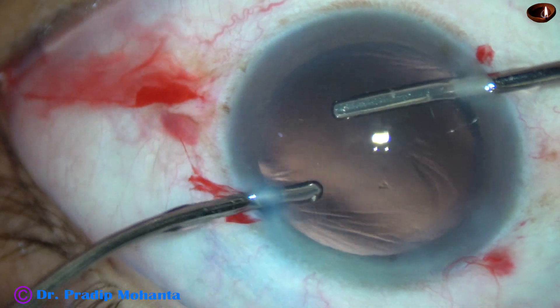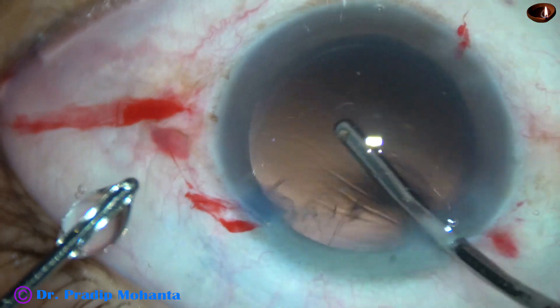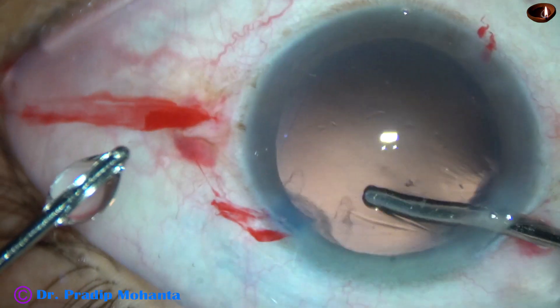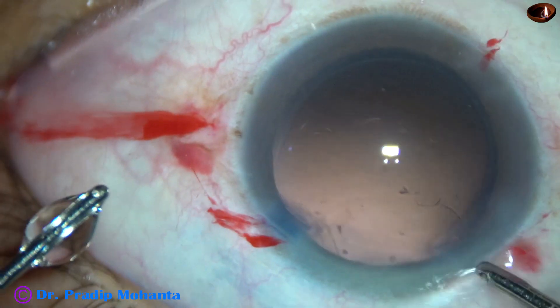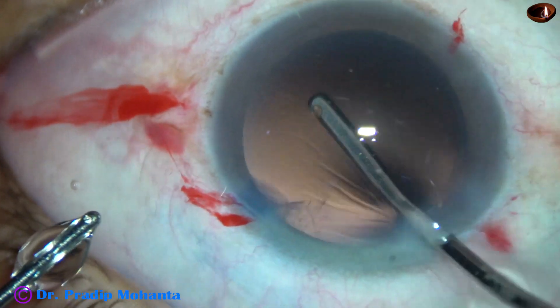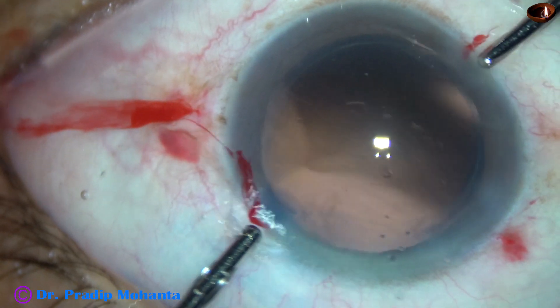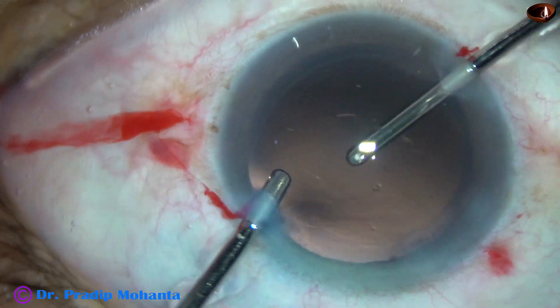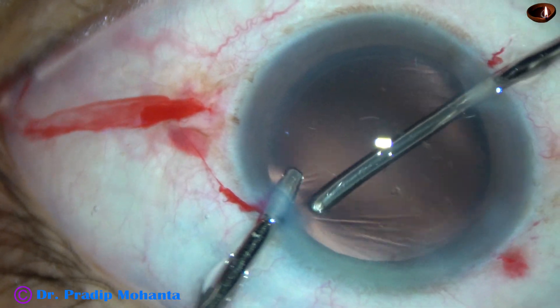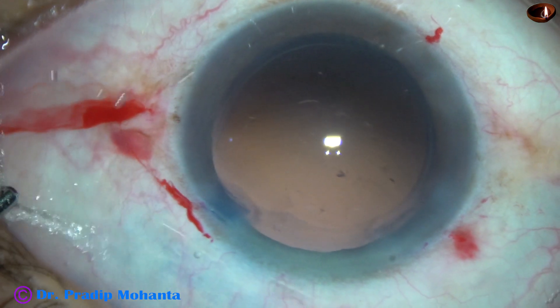See how easily the cortex comes once you hydrate it with your irrigating cannula. So all the cortex has come out — only a few fibers remain at the sub-side-port area. I am hydrating those fibers so that they get detached from the posterior capsule and equated, and now I use the aspirating cannula to remove these fibers. That's it — cortical cleanup is done nicely.